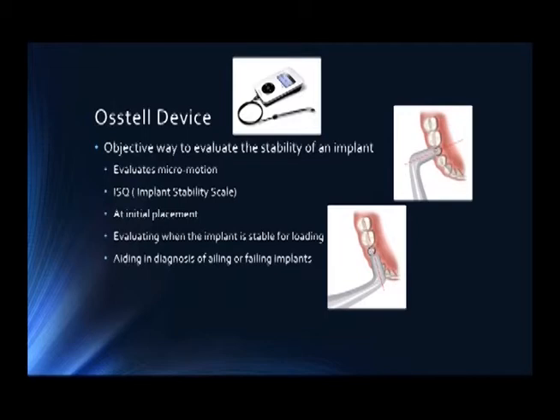In some practices you may not see that, but it actually measures the mobility both from a mesial distal viewpoint and from a labiolingual viewpoint. So it works on micro motion, and it has a scale. It's an interesting device to understand that it exists, and if your office has one, to use for monitoring implants. So I thought you might be interested. If you haven't seen one before, then you at least know how it works and that it's out there.